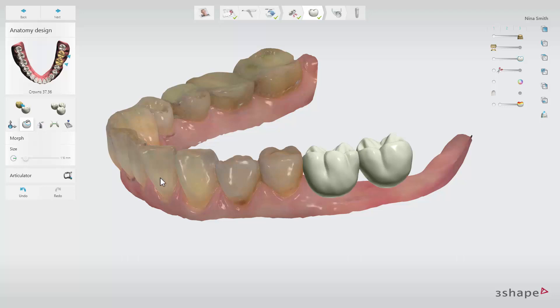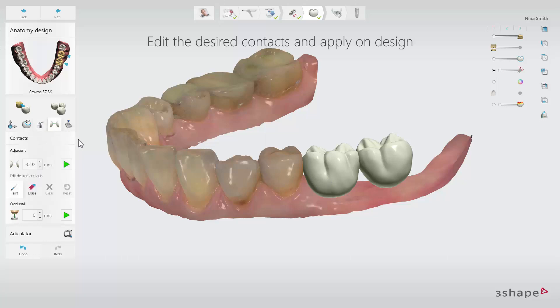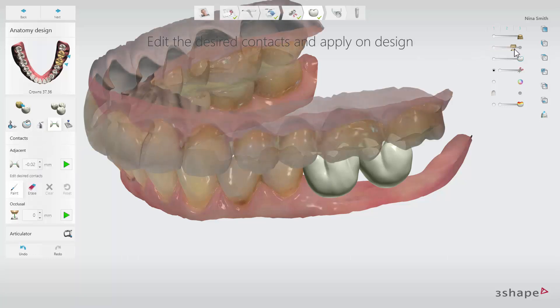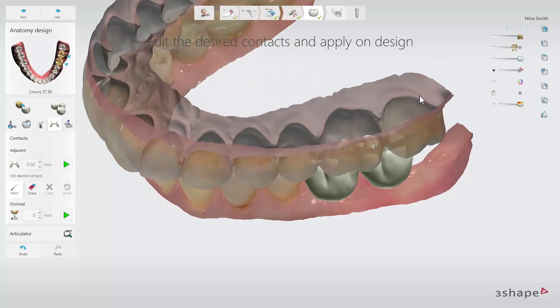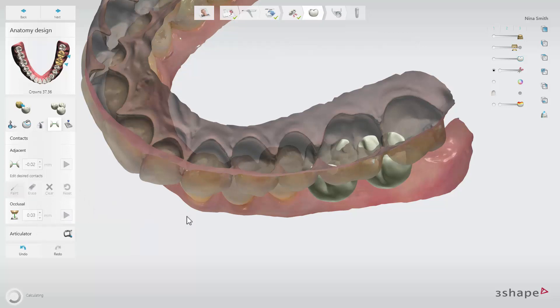You can also use the Wax Knife tool to add or remove material or to smoothen the crown surface. Use the Contacts tool to correct the occlusal contact by cutting the restoration to the antagonist. Set the occlusal space you want and click the Play button to apply it.